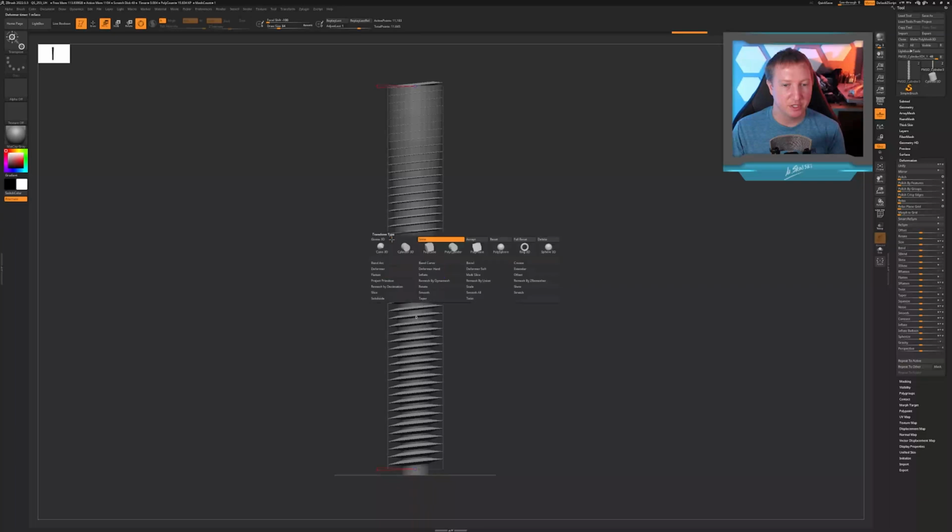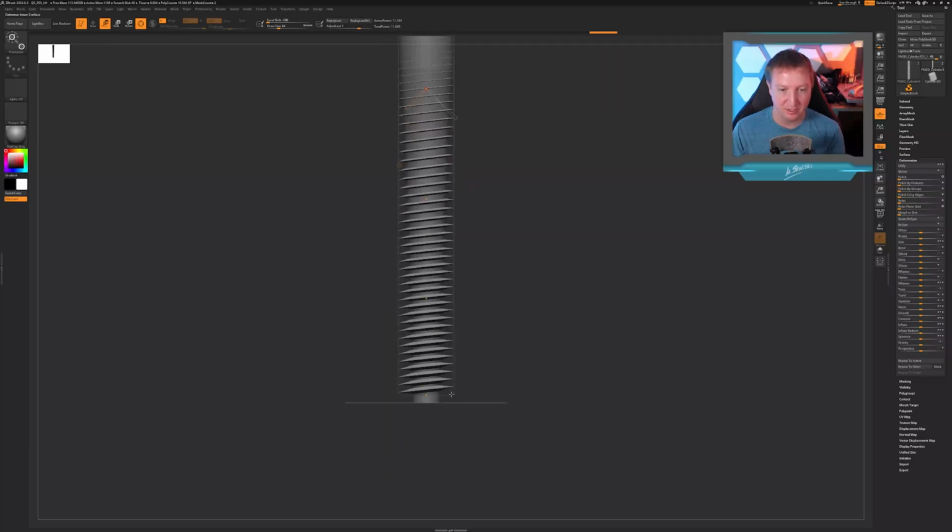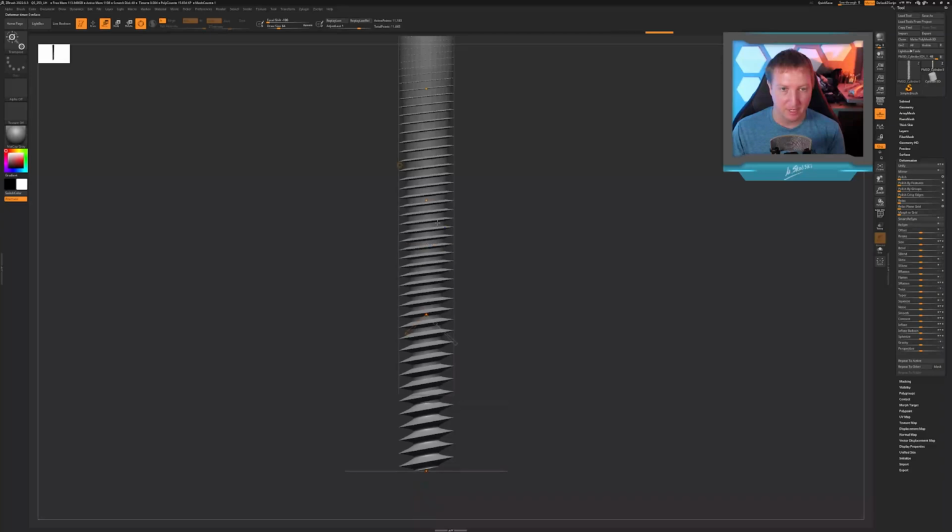And now I need to switch this over to my bend curve menu like we used before, and I need to change the spacing of these threads. So I need to compress the threads near the base of the screw here. I'm avoiding saying head of the screw because the whole point is that it is a headless bone screw, right? And then we need to space these ones further out as we come down here, okay? And so that's looking pretty good.